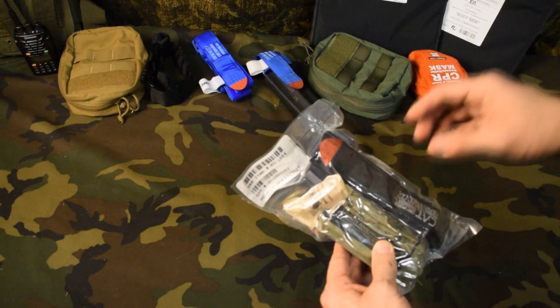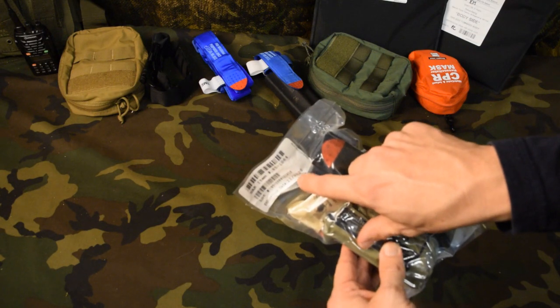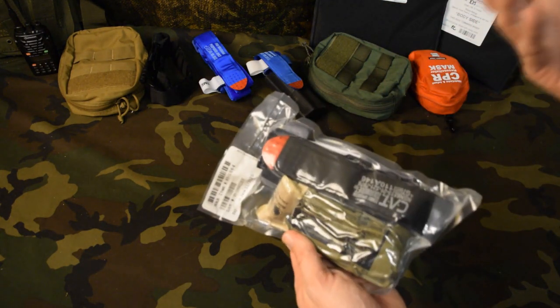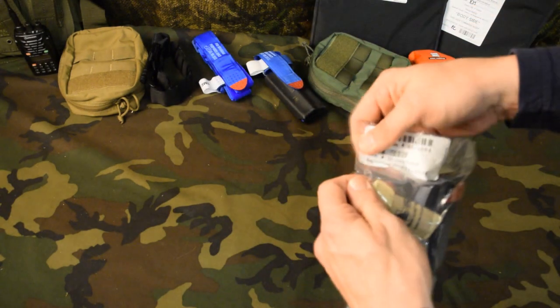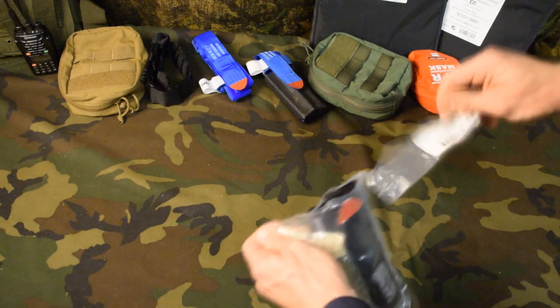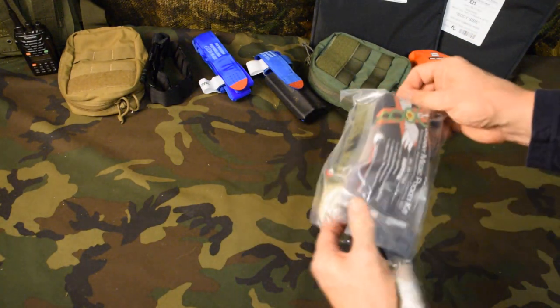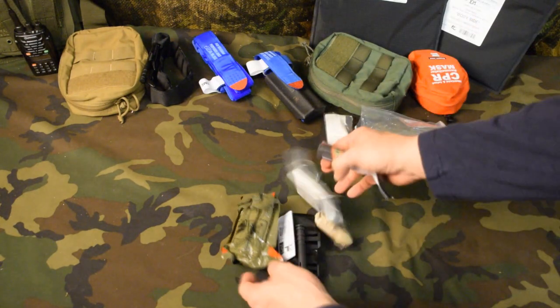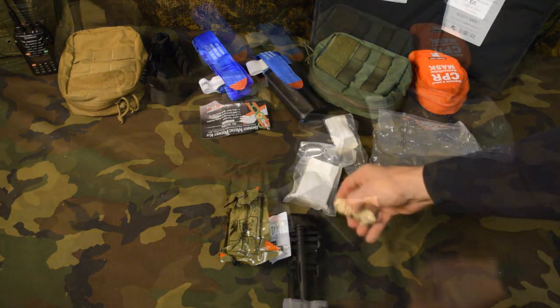We do need to open it up to get to the contents. Take notice that it does have an expiration date — nothing in here technically should expire, but they have to put one. There's a little pull tab with a notch in it to help us open it up. Let's dump everything out and show you everything that's in here.